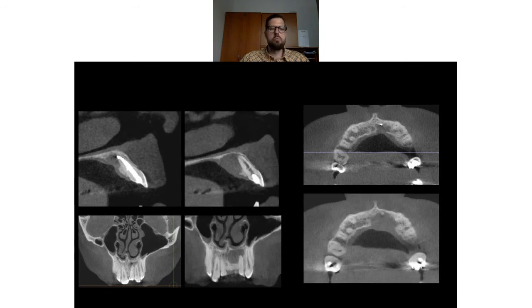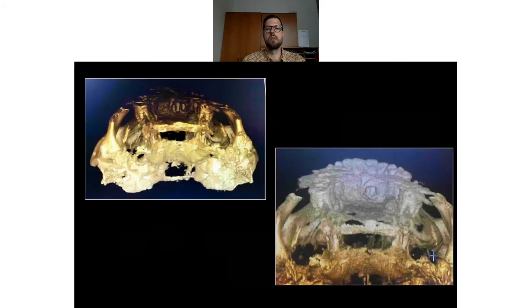And as we compare the situations in 2017 and 2 years after, you see that already the bone on the palatal side is growing. So this is a really good result. And we can check also the 3D reconstruction, and we see that these lesions of the bone are, I would say, 50 or more percent less.